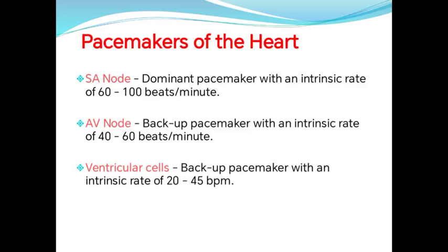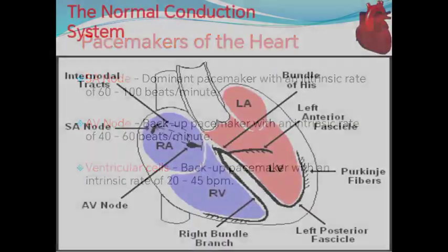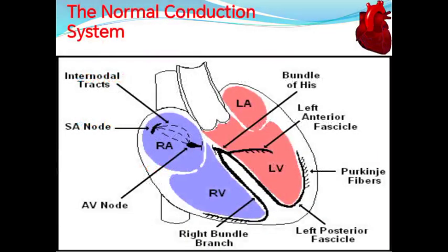So if you find a patient with bradycardia with a slow rate around this rate, definitely assume that patient has a complete heart block. Although we have what's called sinus bradycardia, it is usually a rate above 45, 40 in the patient with sinus bradycardia. We already talked about this.